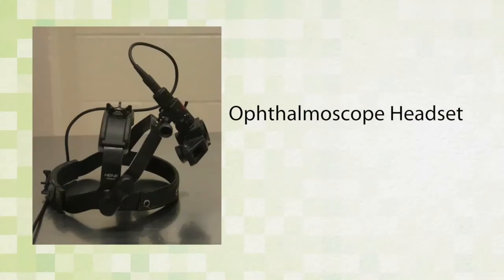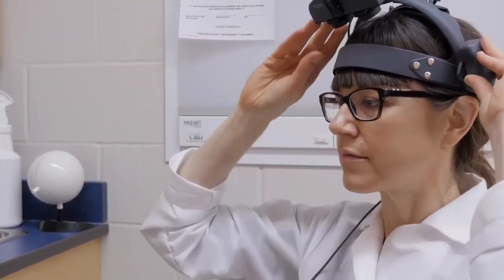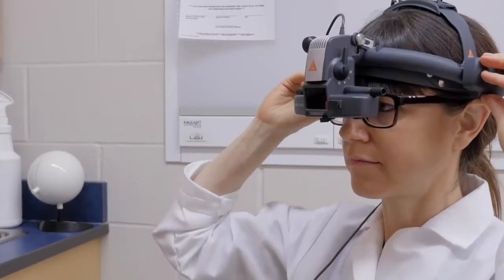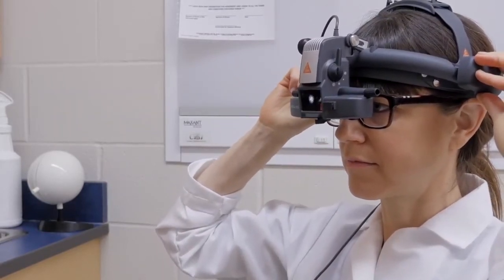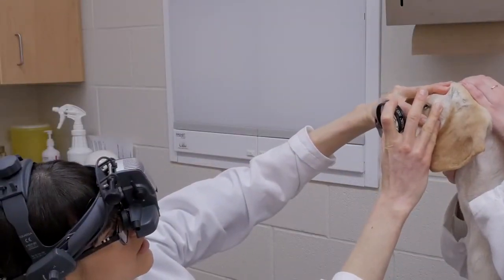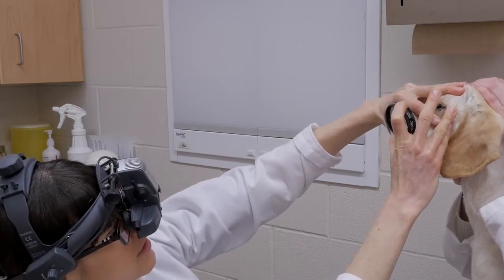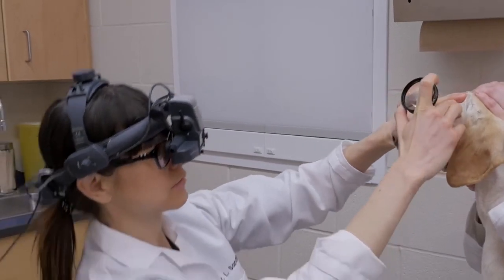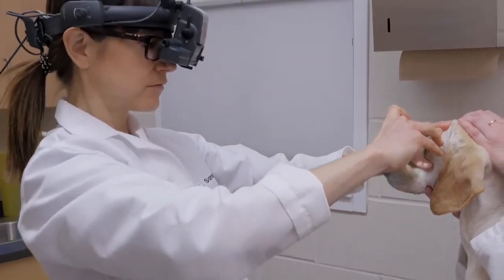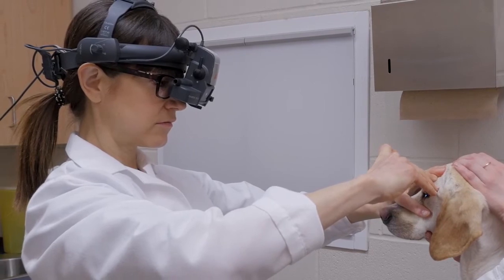To perform binocular indirect ophthalmoscopy, an indirect headset is used as a light source. The patient and lens positioning is the same as for monocular indirect ophthalmoscopy with a transilluminator. The head-mounted light source permits both eyes to be used for the examination, which allows for binocular vision, thus creating depth perception. This allows the examiner to better interpret fundic lesions. The headset also frees up the examiner's hand to allow for better positioning of the animal, its eyelids, and the lens.